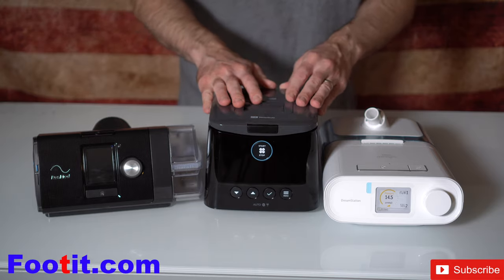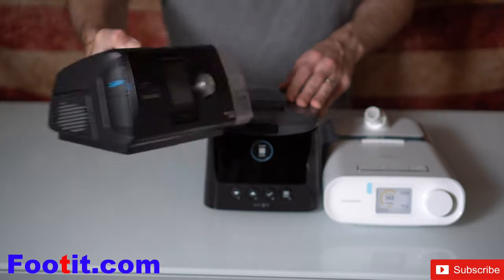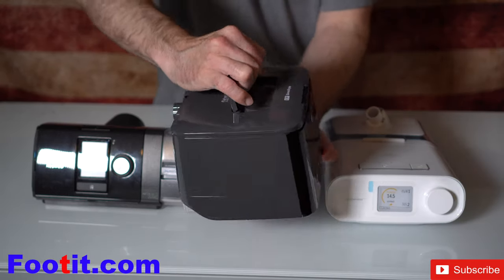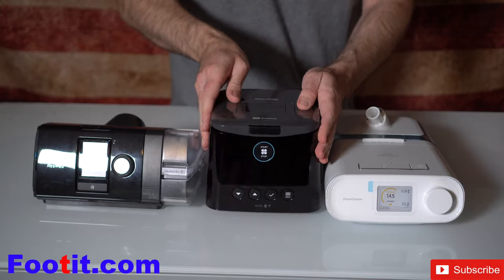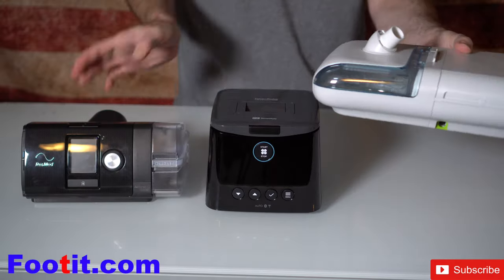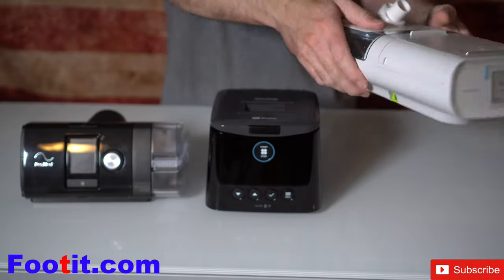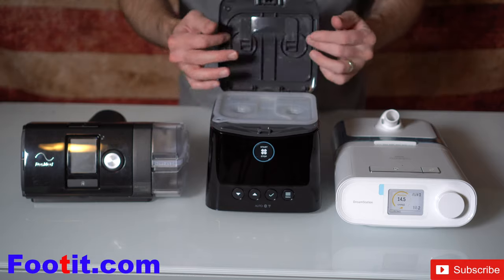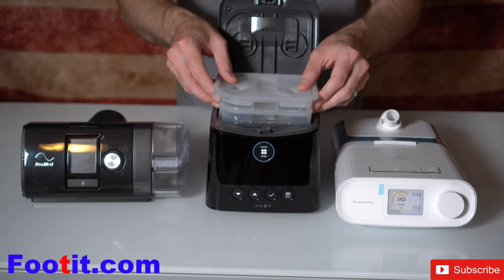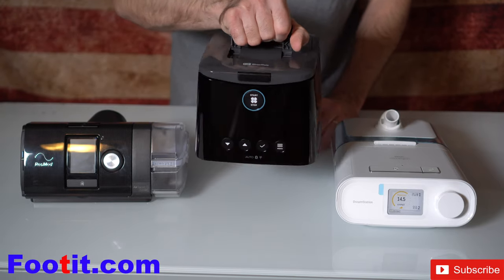Before we get into the review, I just want to give you a side-by-side comparison between the Fisher and Paquel Sleep Style versus the ResMed AirSense 10 and the Philips DreamStation. The AirSense 10 has the humidifier coming out the side, and the DreamStation humidifier comes out the top. Fisher and Paquel did something very innovative — they put the humidifier in the center of the console. I also like the handle; easy to carry and transport if need be.